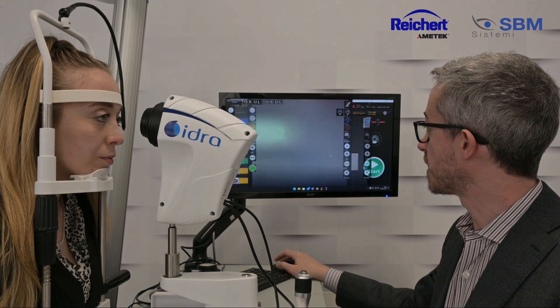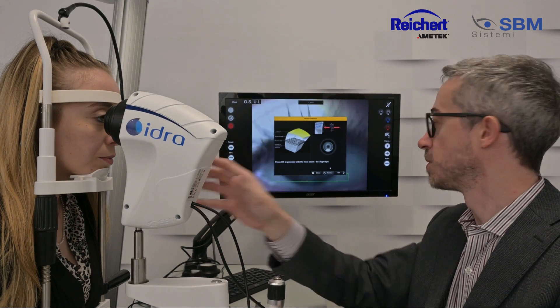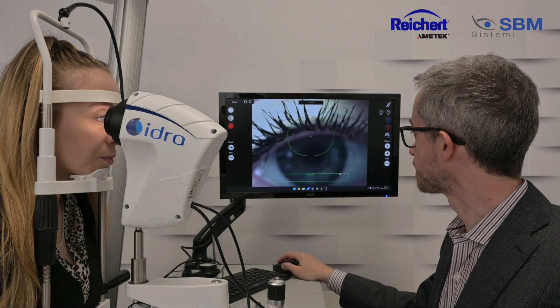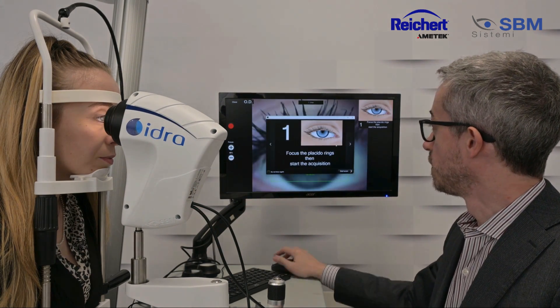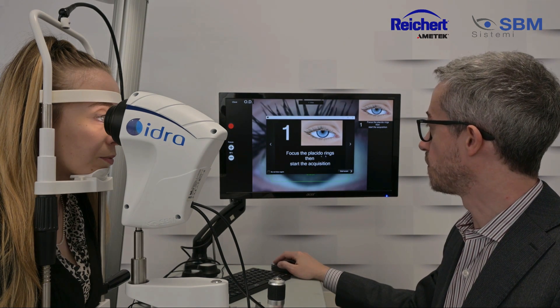We start the Fast Wizard and we start, as usual, from the right eye. Following the instruction for the Fast Wizard, we have to focus the Placida rings.